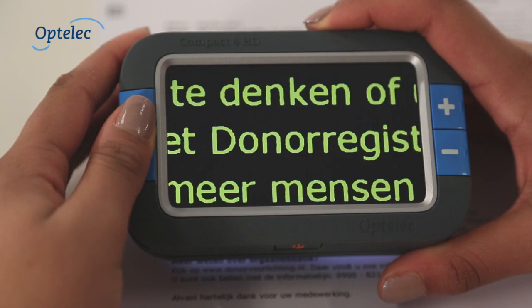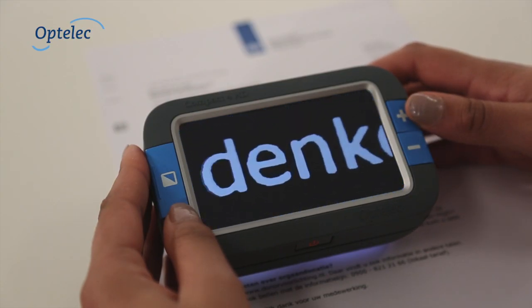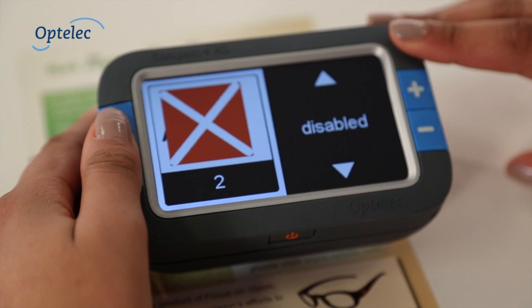Changing the viewing mode, colors, or magnification settings continuously from 1.7 to 12 times the original size means that adjusting the Compact 4HD to your wishes is easy.